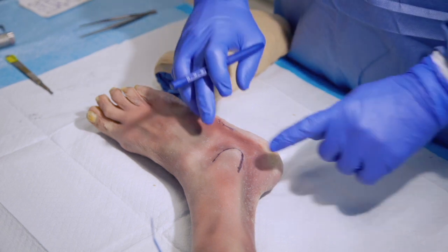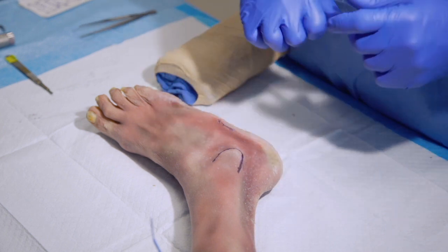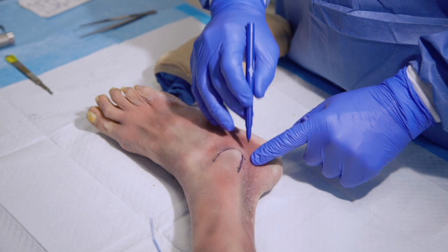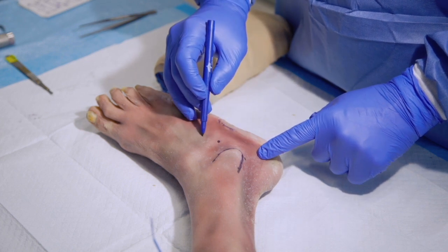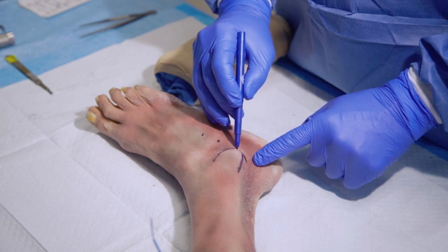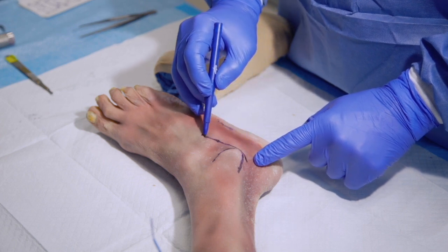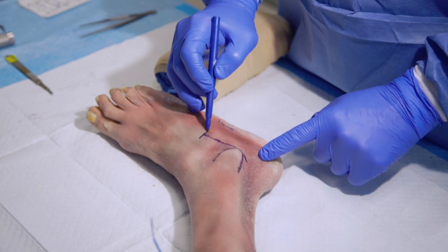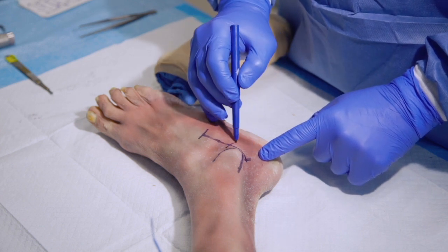The landmarks are the tip of the fibula, the peroneal tendons, the sinus tarsi, and the anterior aspect of the calcaneus. The incision falls along the superior aspect of the peroneal tendons over the sinus tarsi area, then ending at the anterior calcaneus region.